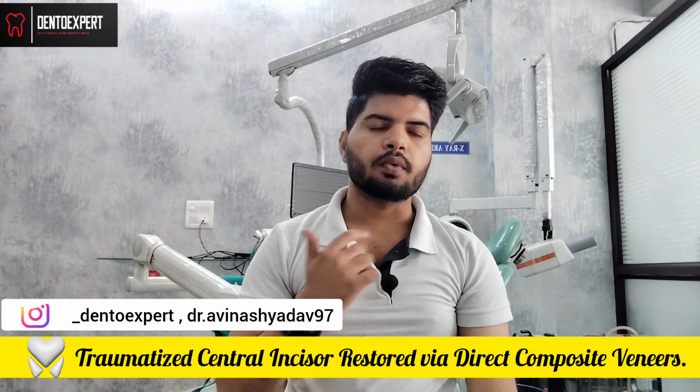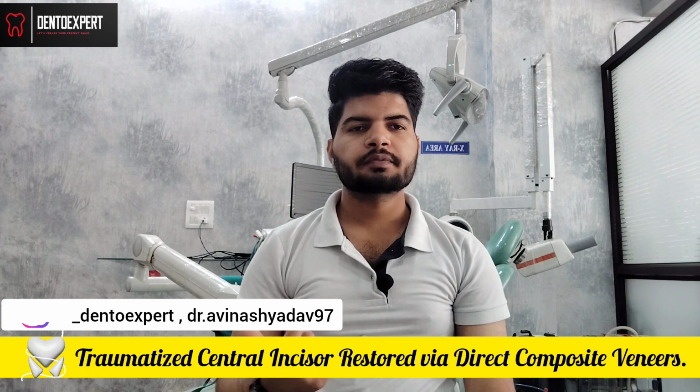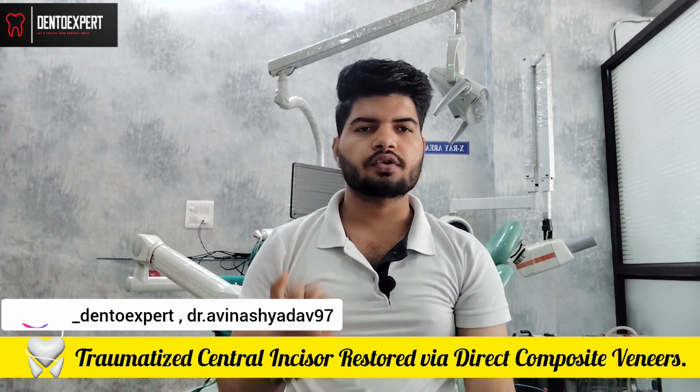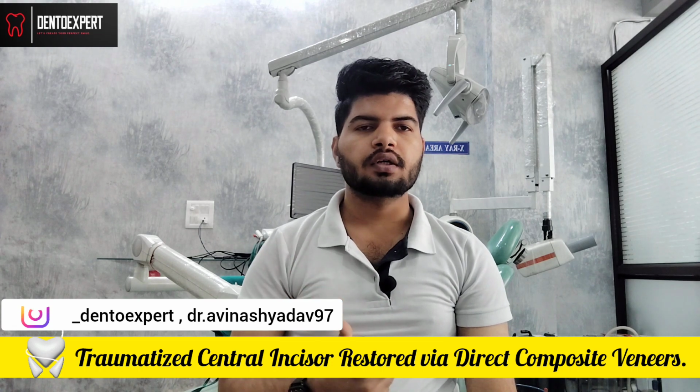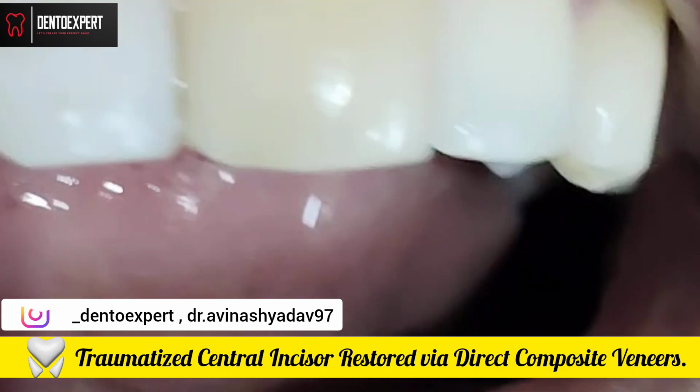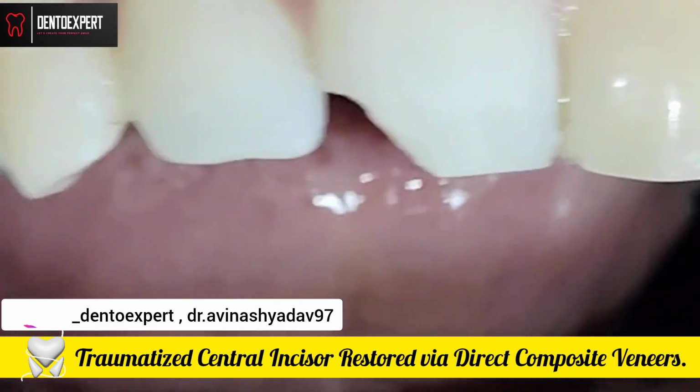The fracture involved both dentin and enamel, which is basically a Class 2 in Ellis classification of tooth trauma. Now have a look at the fracture amount of the tooth. Look, this is the amount of tooth structure lost.